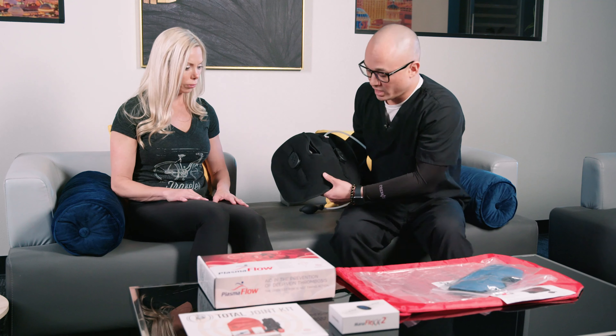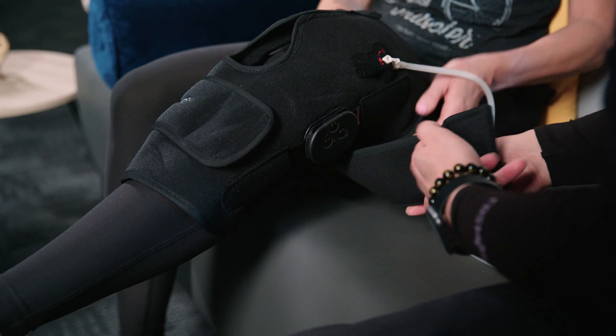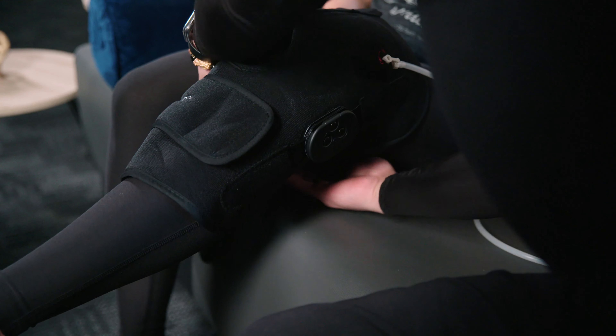To put it on, you have your leg bent or you can have it extended. Bottom strap for your calf — you want that nice and snug. Top strap goes behind your thigh and back to the front.